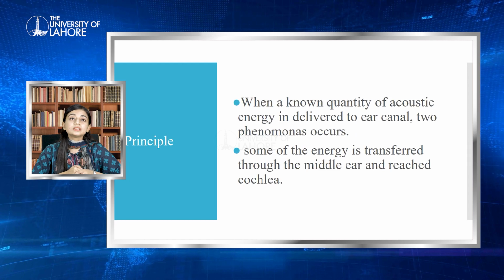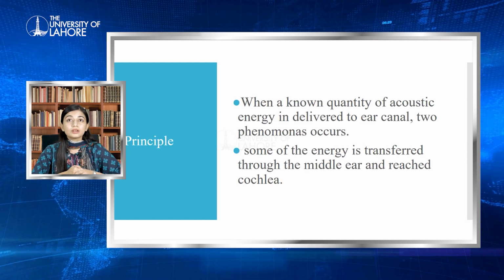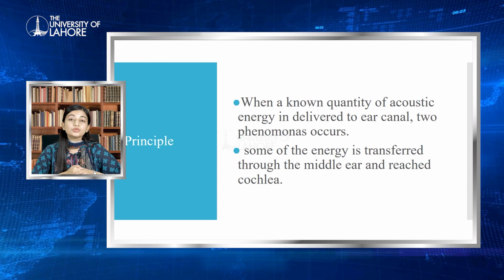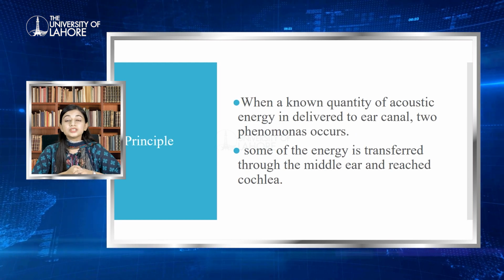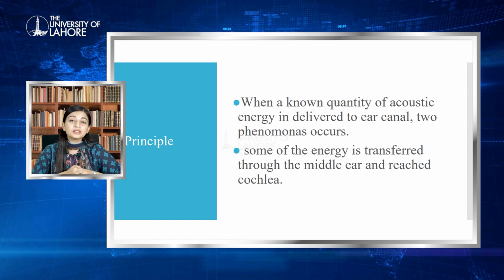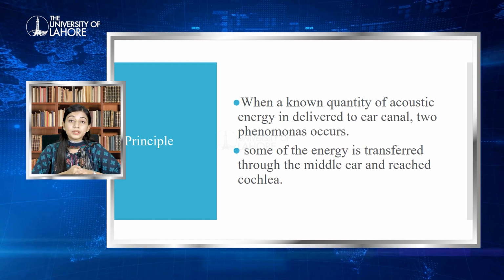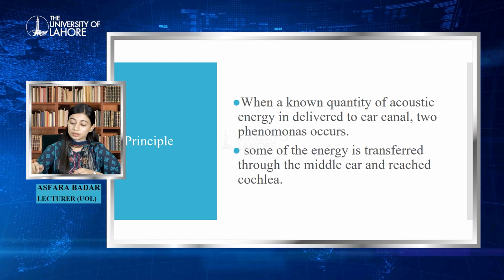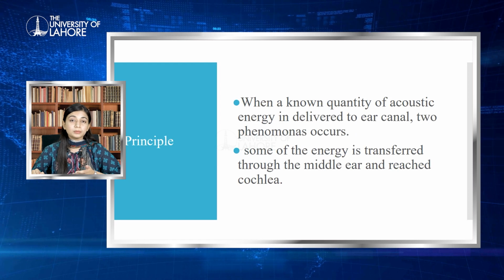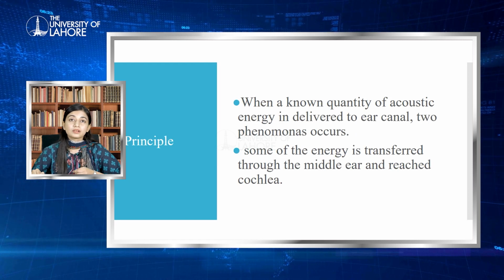Now we will discuss the principle. When a known quantity of acoustic energy is delivered to the ear canal, two phenomena can occur. Some of the energy is transferred and some of the energy will be reflected. The reflected energy will be based on the impedance. If the impedance is increased, then the reflected energy will automatically increase.